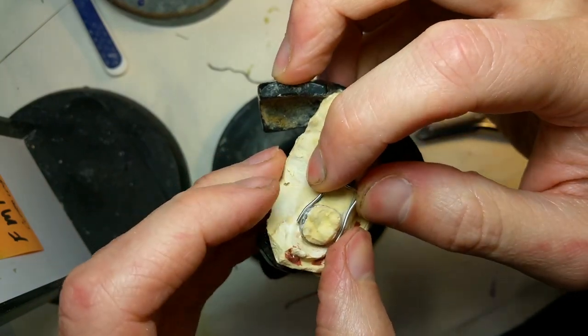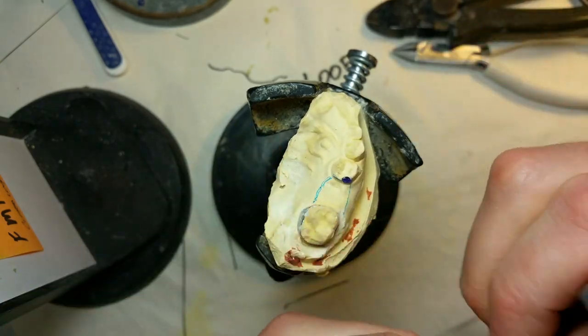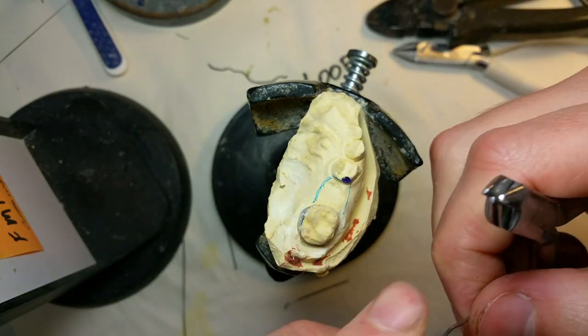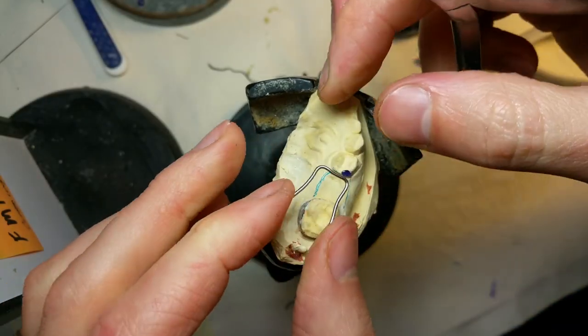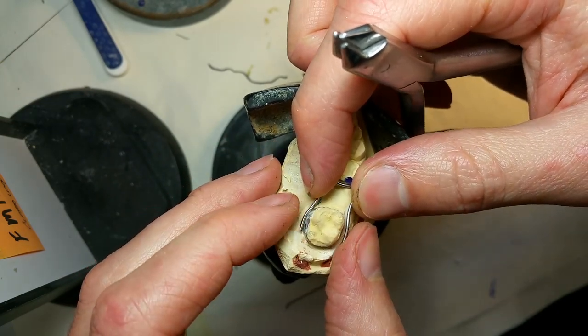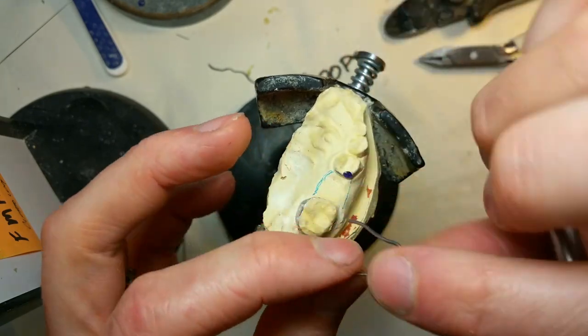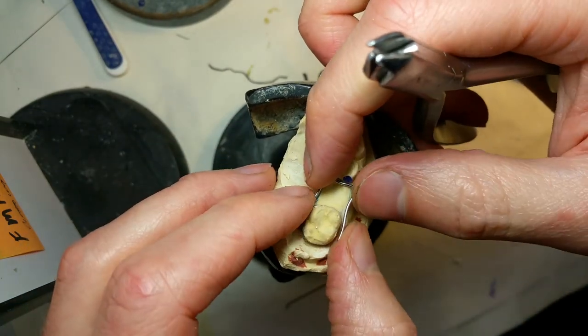We're about seven minutes in and we've got two done. These are actually pretty easy to make. If you're in-house, sometimes you do have to do a one-arm version. It depends on the teeth — sometimes one tooth is at an angle and you've got to kind of match it.